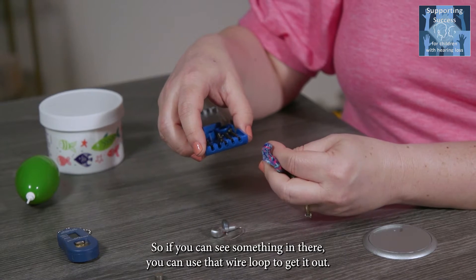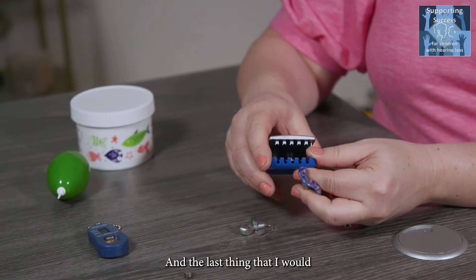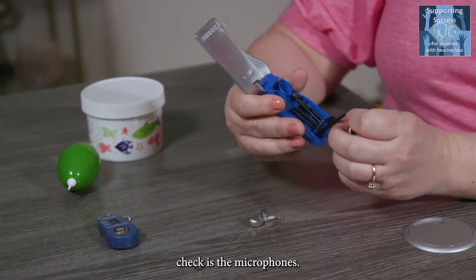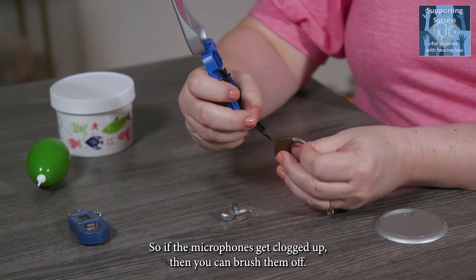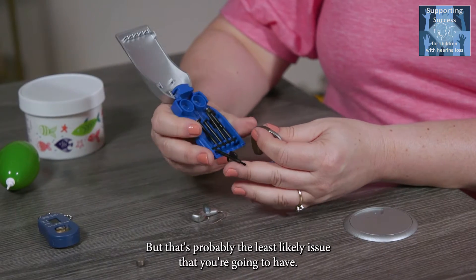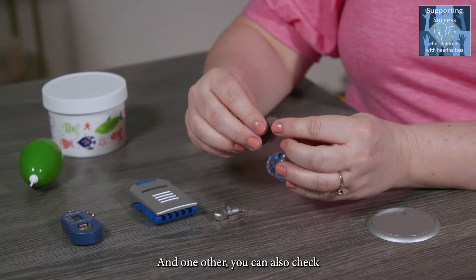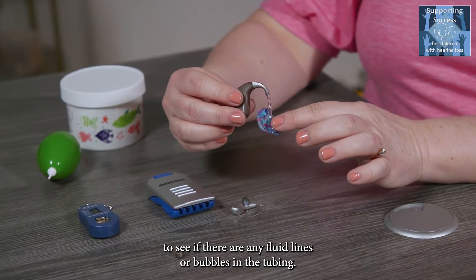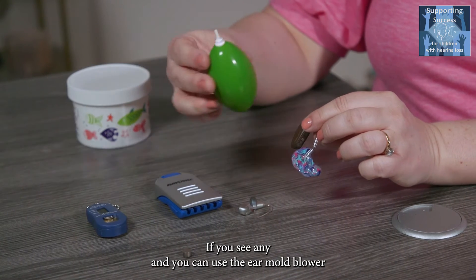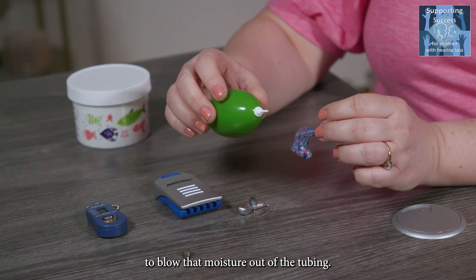If you can see something in the tubing, you can use that wire loop to get it out. The last thing to check is the microphones — if they get clogged up, you can brush them off, though that's probably the least likely issue. You can also check for any fluid lines or bubbles in the tubing, and if you see any, use the ear mold blower to blow that moisture out.